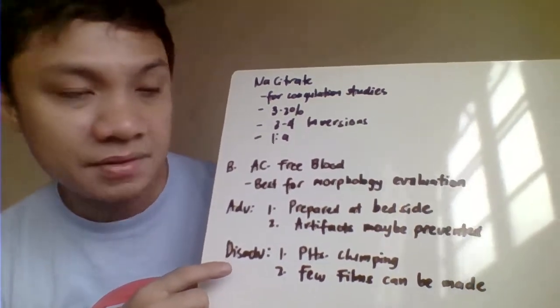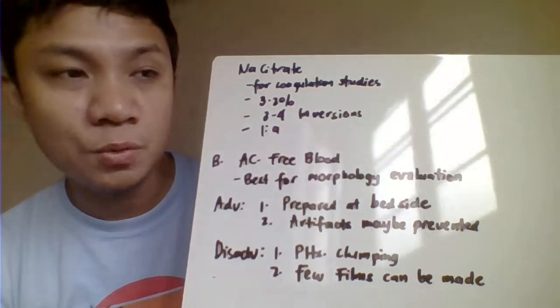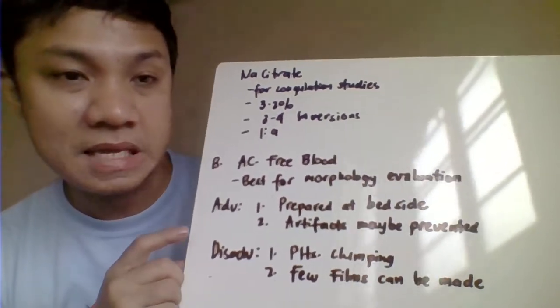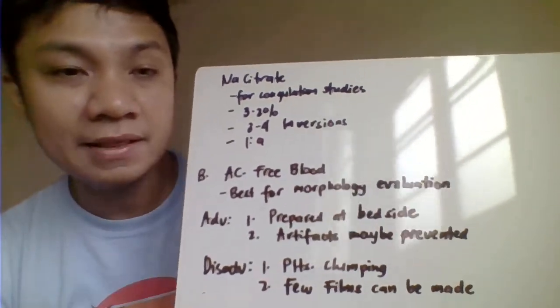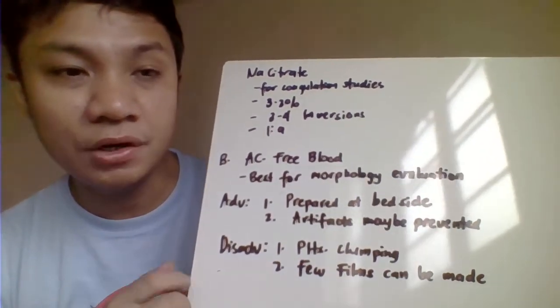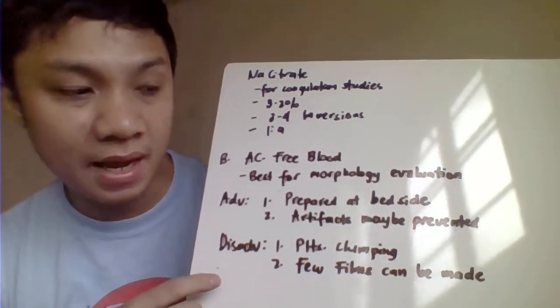Another one, artifacts may be prevented, so again, this is less prone to contamination, and therefore making this one ideal for your morphology evaluation. Disadvantage, since you are only collecting a limited amount of blood because this one is a skin puncture, therefore, only a limited number of films could be made here at the patient's bedside.